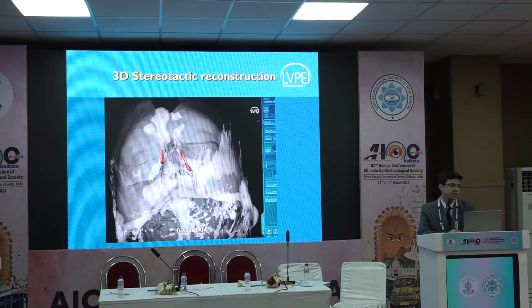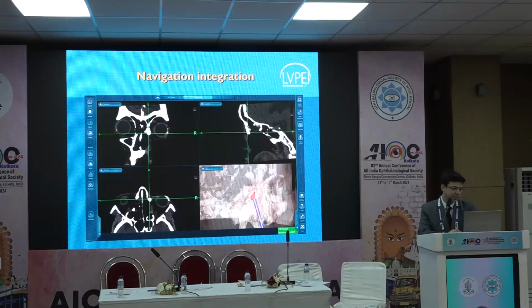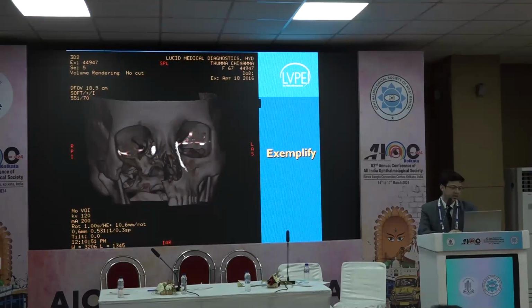Towards opening into the nasal cavity. So there's a nasolacrimal duct blockage on the right side. Then this CT-DCG scan can be incorporated into the navigation system, where you can localize the lacrimal sac in the 3 different planes and even in 3D reconstructed orbits.